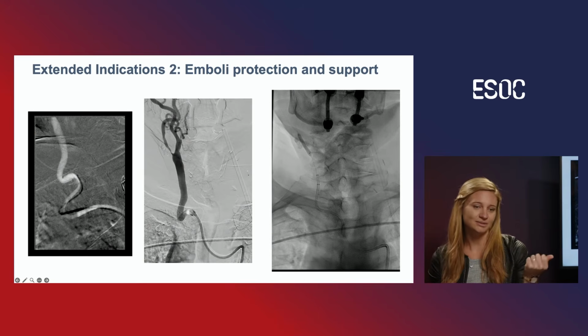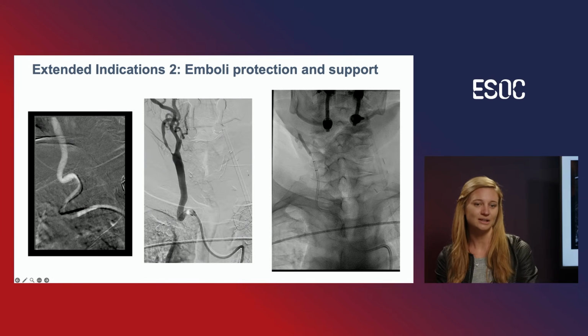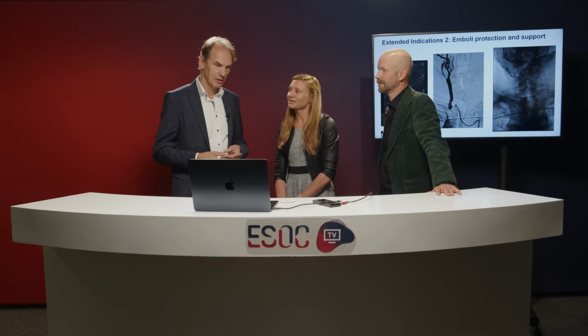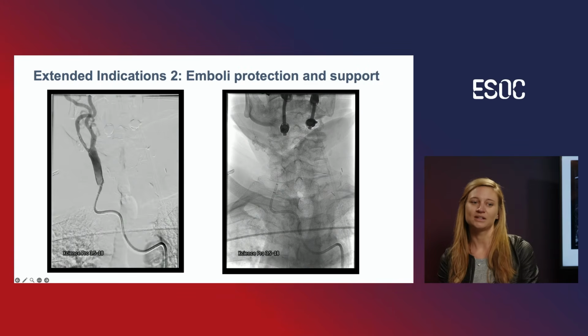It was a technique that worked to bring the balloon guiding directly into the common carotid artery. This is again difficult anatomy, and this is how you can use it to overcome the difficult anatomy. And then we have it at the right position to open the balloon and have the emboli protection during the stenting procedure. Yeah.